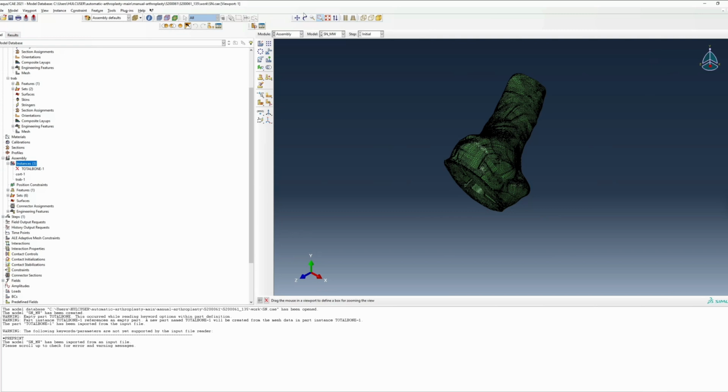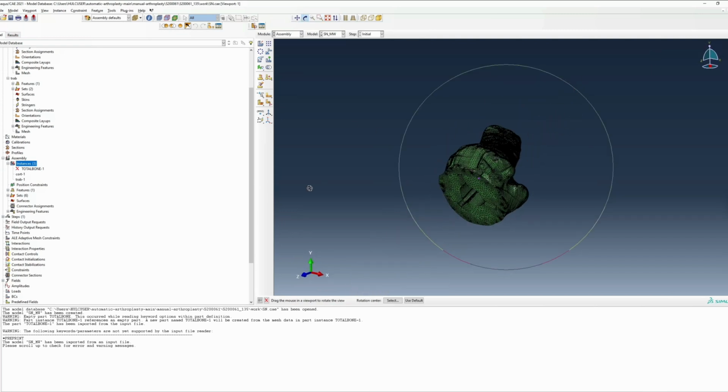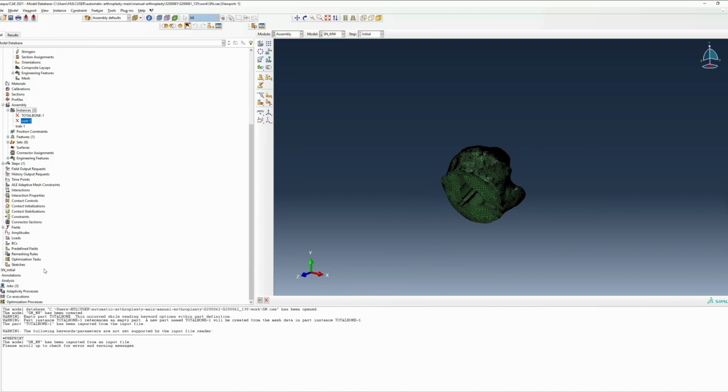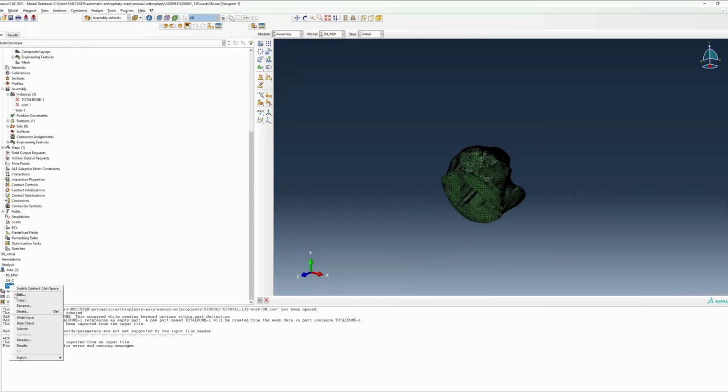After you've recreated cortical and trabecular meshes, go back and suppress your cortical model to create a trabecular input file, and vice versa. These current existing mesh files will then be able to be uploaded to Mimics for material application.